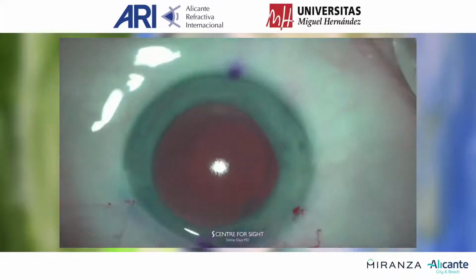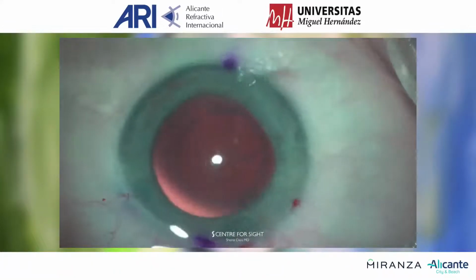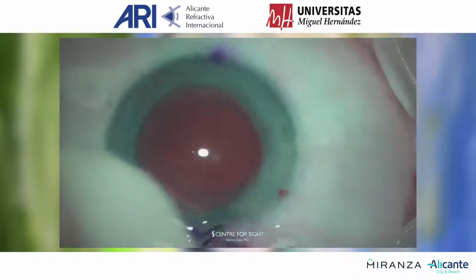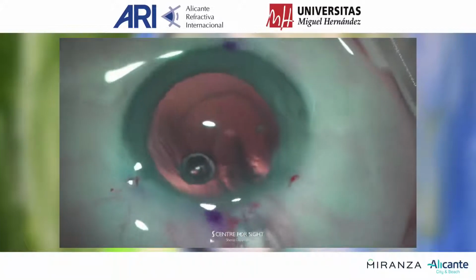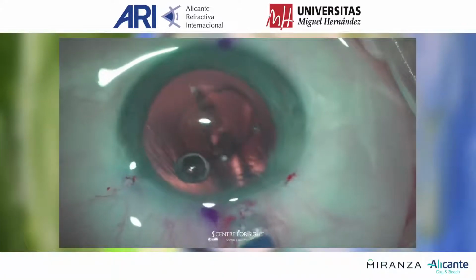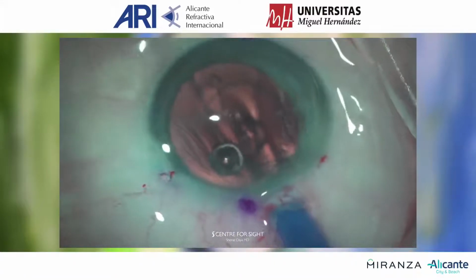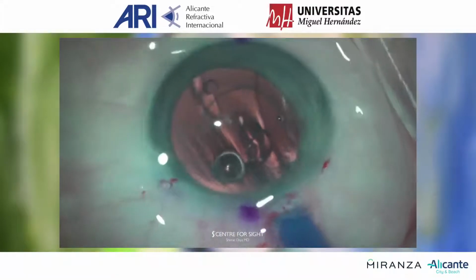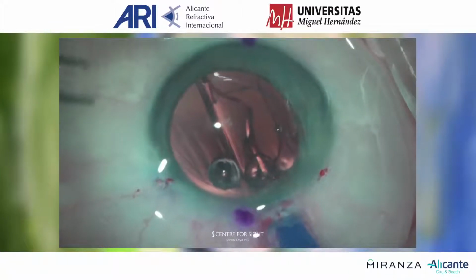Viscoelastic is injected into the capsular bag. And this is a Zeiss AT Torbi toric monofocal lens being injected, of power 0.00 and a cylinder of plus 1.50. This is injected in the capsular bag.